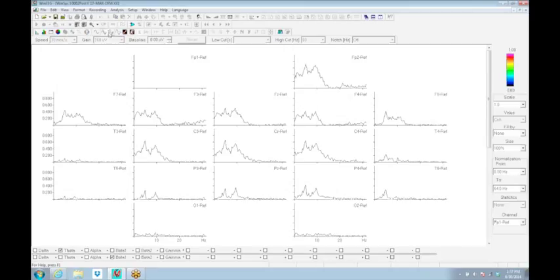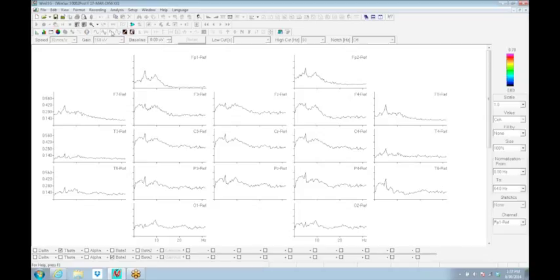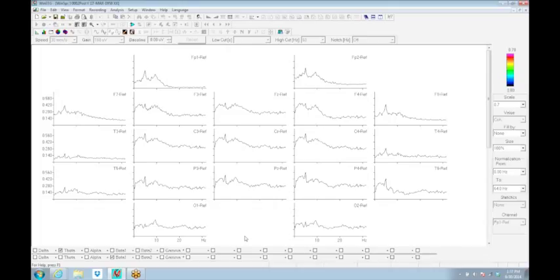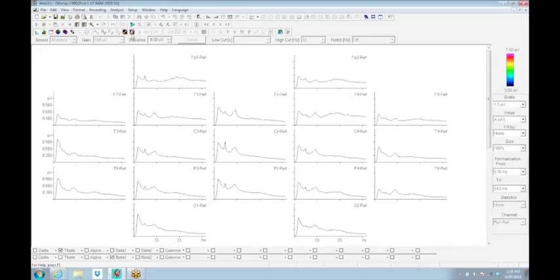I usually, the pairwise coherences, they're better than not looking at how something's connected. But how things are connected on the average, the average coherence is, I think, more like a multivariate. When I look at coherence, this is what I look to, to see whether something is over-connected, under-connected, not active, hyper-coherence in alpha. Frontally, you end up seeing a real big peak in alpha, and you'd see the mapping of all the alpha being high frontally. Biofeedback field don't work in those areas. They work primarily in the raw spectrum through the Fourier.